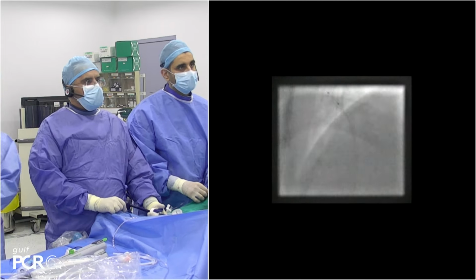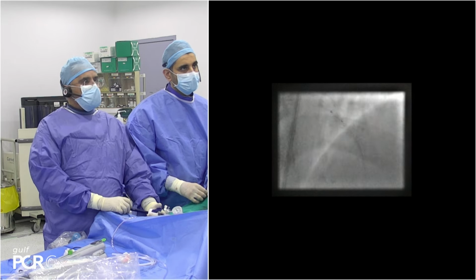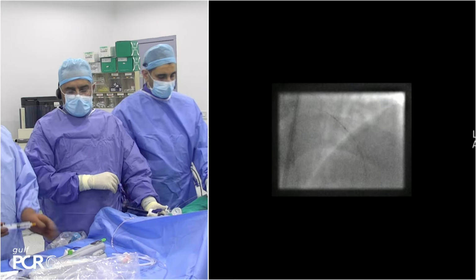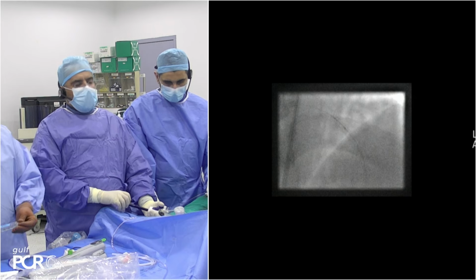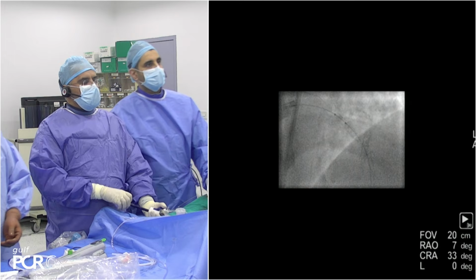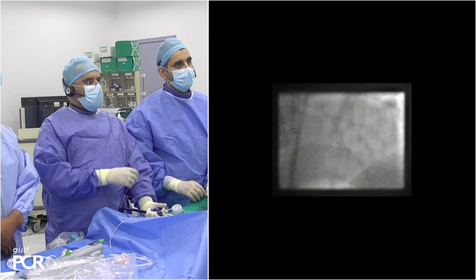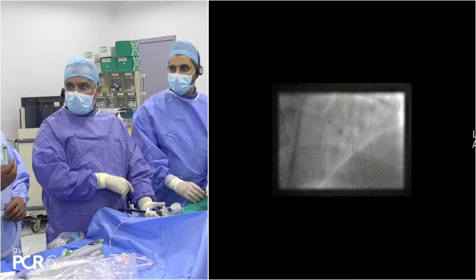Show me higher. You see, the problem, Khalid and Abdullah, is that you have an eccentric lesion here, so you might find it fully opened in one view, and it could still be not. Yes, that's what we did, Ibrahim. We took different angulations, and in both angulations, and then we'll do imaging at the end. Okay. Maybe after the balloon, we need a control angio to see if the haziness is gone or not. Definitely will do that. Ibrahim, we will show you what we've done. We've done the balloon inflated in the AP cranial and the RAO caudal, and the balloon was open in both angulations, and the same thing with the stent. Stent viz, yes.